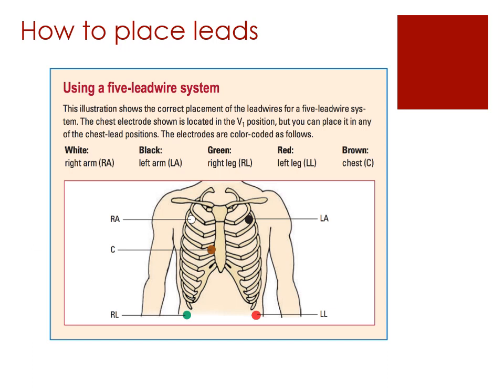And you might hear there's several mnemonics. You can ask your nurses, there's several ways that you can put it on there. But white is right, smoke over fire, that's probably the most common that you will see. So white is right, black is left, green is below the white, and red is below the left, and then the brown is in the middle.